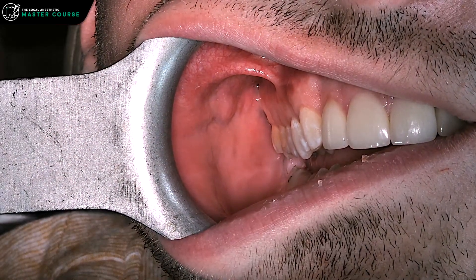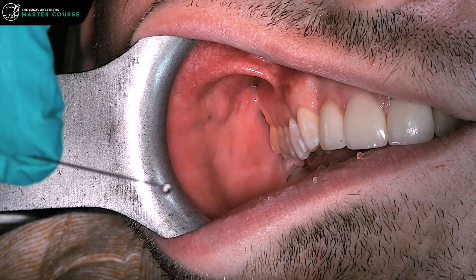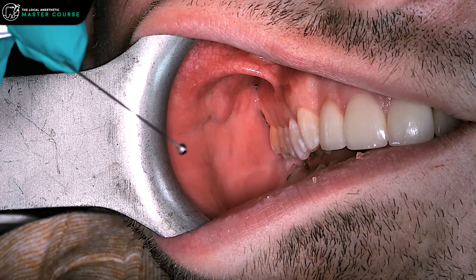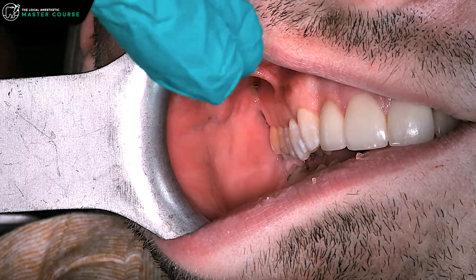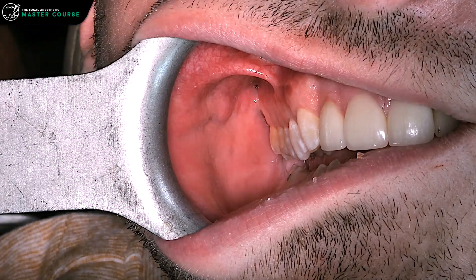Just as with the PSA block, one of the most important things for access is to bend the needle — bend it over just like we're doing here to get a better angle in that area without angling the barrel too much, because you want to stay on your 45/45/45. Don't bend it right over the patient's face; do that somewhere privately before you go to inject.